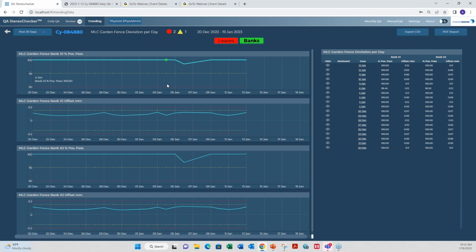And we saw, looking at those daily results, that the banks were clear and fine. So we separate the bank criteria tests. It's just graphically displayed a lot easier that way. You get the graphs as well as the table data. And again, anything that you want to go look at, you just click on the underscore and you can do that. But this is the summary of those results.